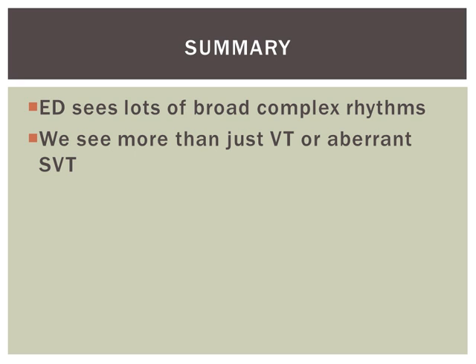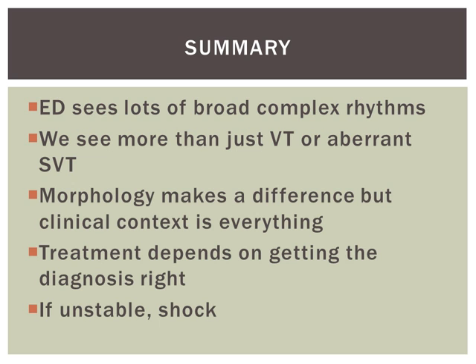So in summary, ED sees lots of broad complex rhythms. We see more than just the diagnosis of VT or aberrant SVT. Morphology does make a big difference, but clinical context is everything, and treatment depends on getting the diagnosis right. Remember, if the patient is unstable with a broad complex rhythm, the treatment is shocking.